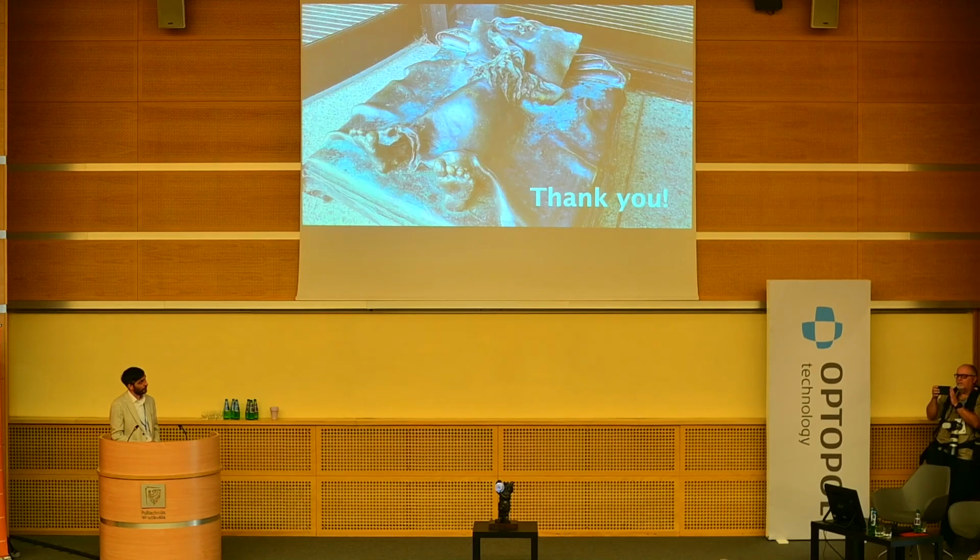Yeah. So I think that the issue with imaging the choroid, as we've seen in some of these images, is that the light has to pass through the retinal pigment epithelium first and then through the choroid, which contains all these blood vessels, which attenuate the light beam, and then also the pigments in the choroid, which may differ from eye to eye, depending on how darkly your eye is pigmented. You may or may not see the end of the choroid.